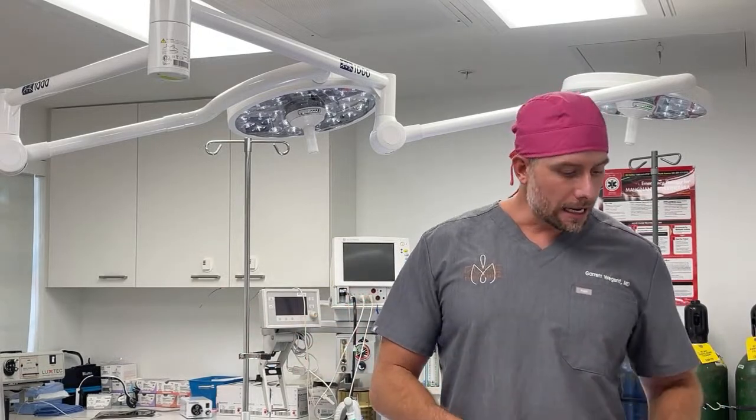First is the question of saline versus silicone. So what does that mean? A saline implant is one that comes as an empty shell, something like this, that we actually have to fill up. This is actually a temporary sizer that we can use during procedures before choosing a permanent implant, but it has this little hose attached to it. You can fill it up with saline, salt water. And that means you can adjust the size a little bit, even though it has a set size that it's supposed to be filled to.